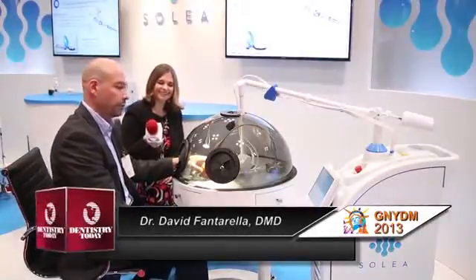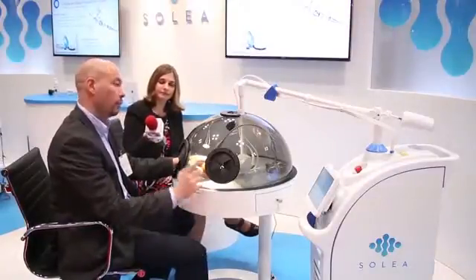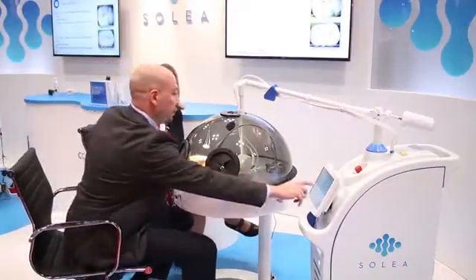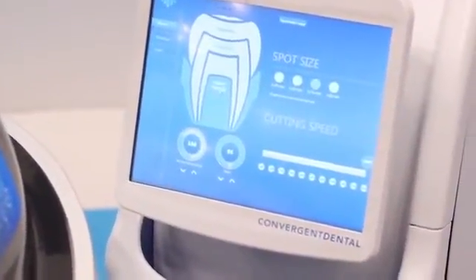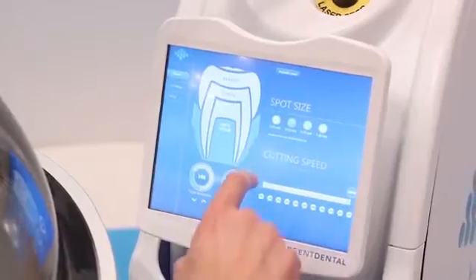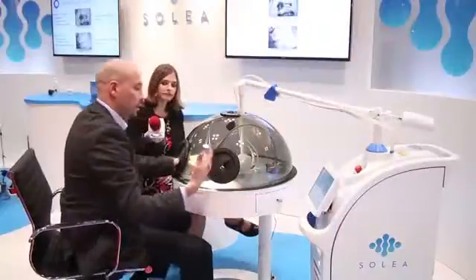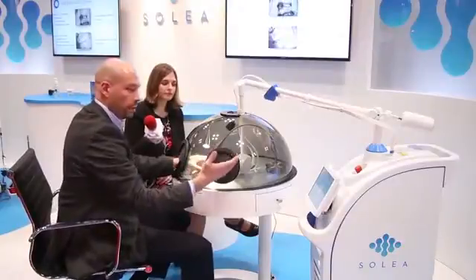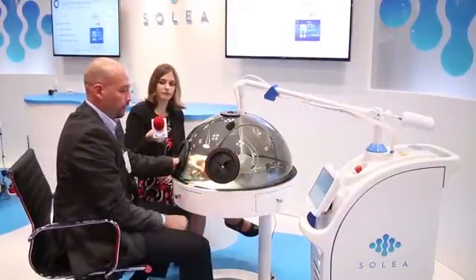Okay, so first what we'll do is we'll simulate some soft tissue while cutting out a tomato. What we do is we select soft tissue and we determine our pulse duration and the amount of water we would like and our spot size. Then we activate the laser. The laser begins to prime with water. We make sure that that's occurring. Click OK. Five beeps and we're ready to go.